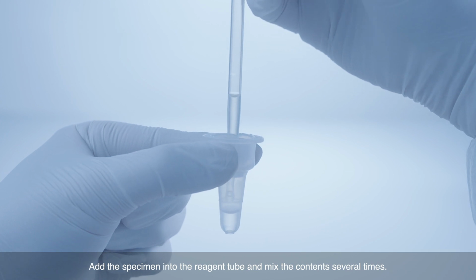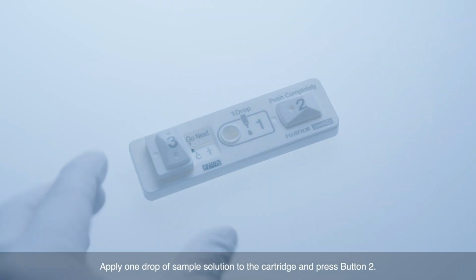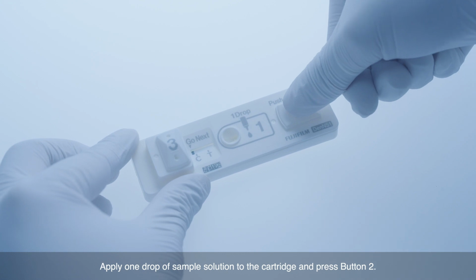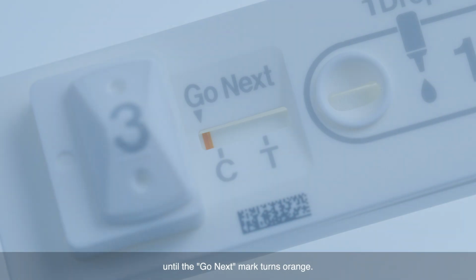Step 1. Add the specimen into the reagent tube and mix the contents several times. Step 2. Apply 1 drop of sample solution to the cartridge and press button 2. Wait approximately 15 minutes until the Go Next mark turns orange.